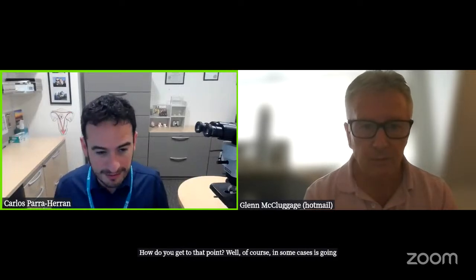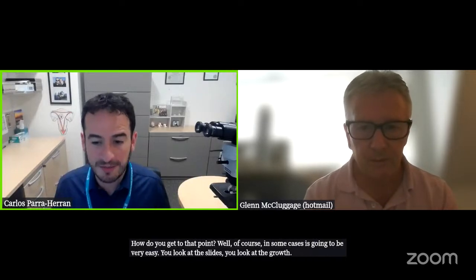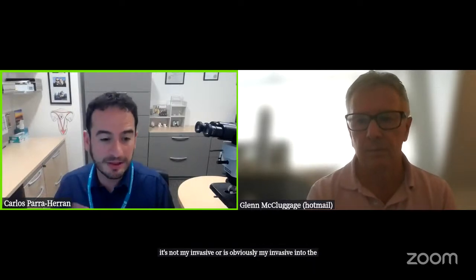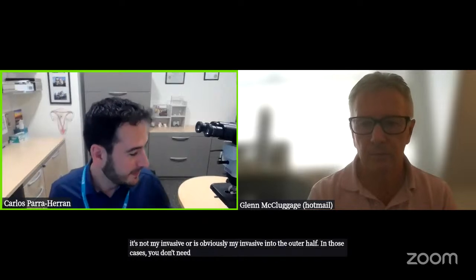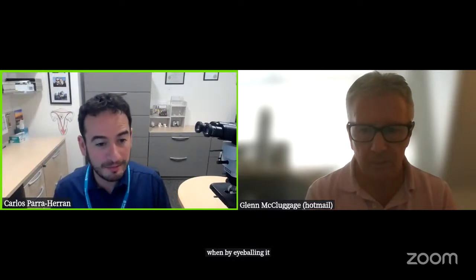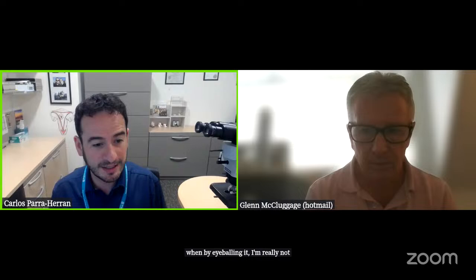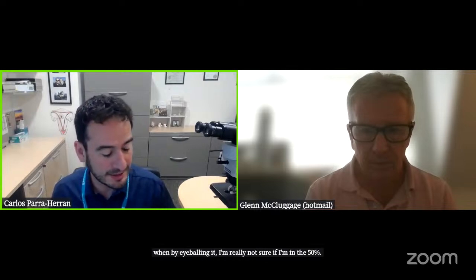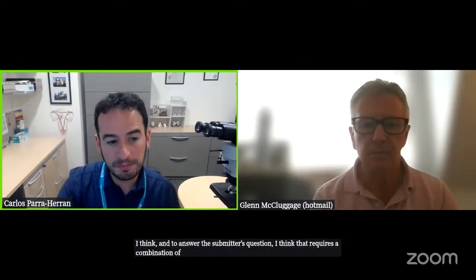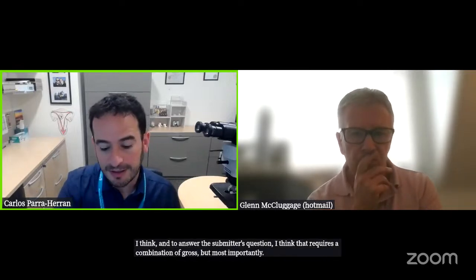You look at the slides, you look at the gross, it's not myoinvasive, or it's obviously myoinvasive into the outer half. In those cases, you don't need to really grab a ruler. I grab a ruler when, by eyeballing it, I'm really not sure if I'm at the 50% threshold or not. To answer the submitter's question, I think that requires a combination of gross, but most importantly, microscopic evaluation.